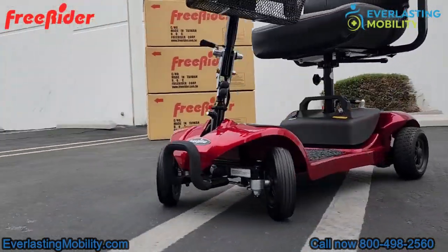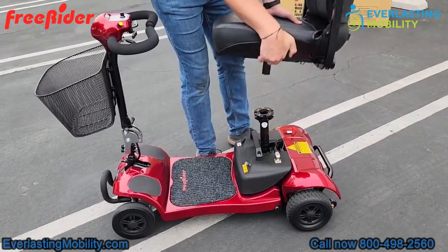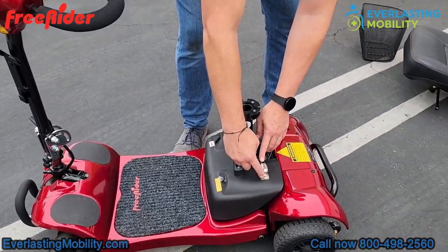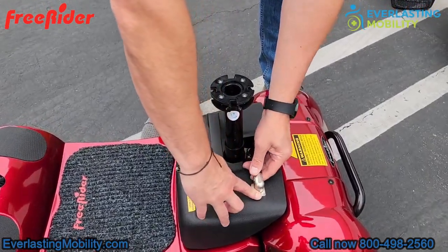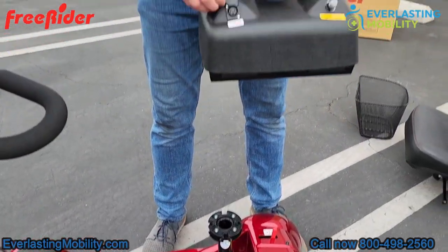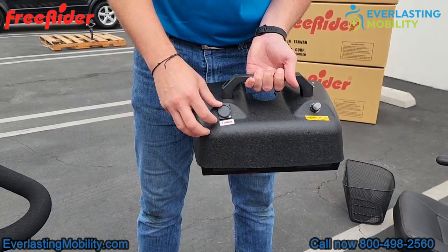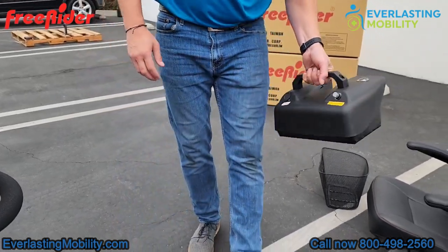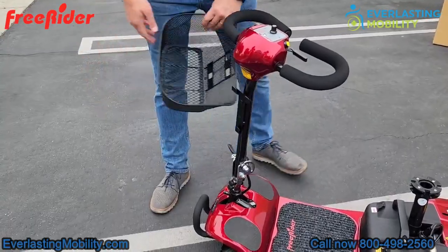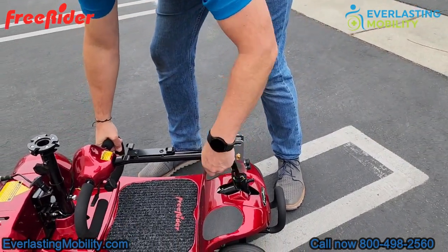One of the great features of the Ascot 4 is how easy it is to disassemble for transport. First, fold the seat back down and use the swivel lever to pop the seat right off. Next, unplug the wire from the battery pack and lift it off. The charger is located directly on the battery pack, so you can charge it while it's on the scooter or remove it and charge it inside your home — two convenient options. Then pop off the front basket and use the tiller knob to adjust it all the way down to the base and lock it.